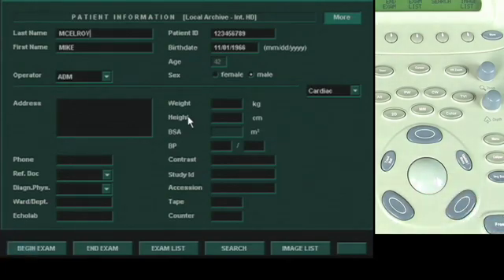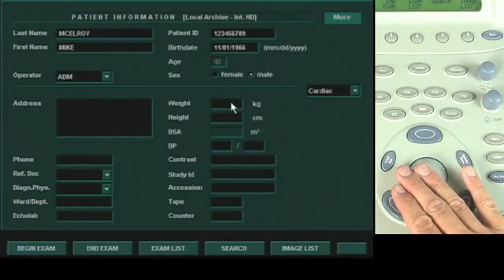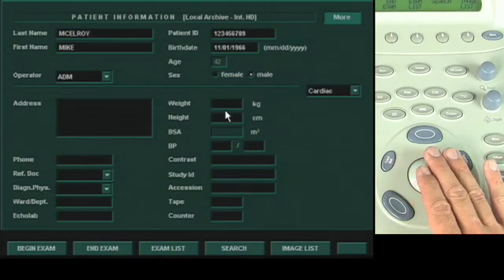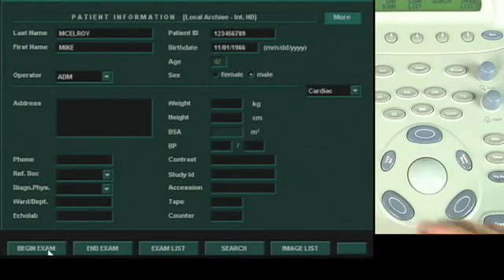And now it will typically bring us up to a second window where it would like the height and weight. When we're done with that, we just select Begin Exam.